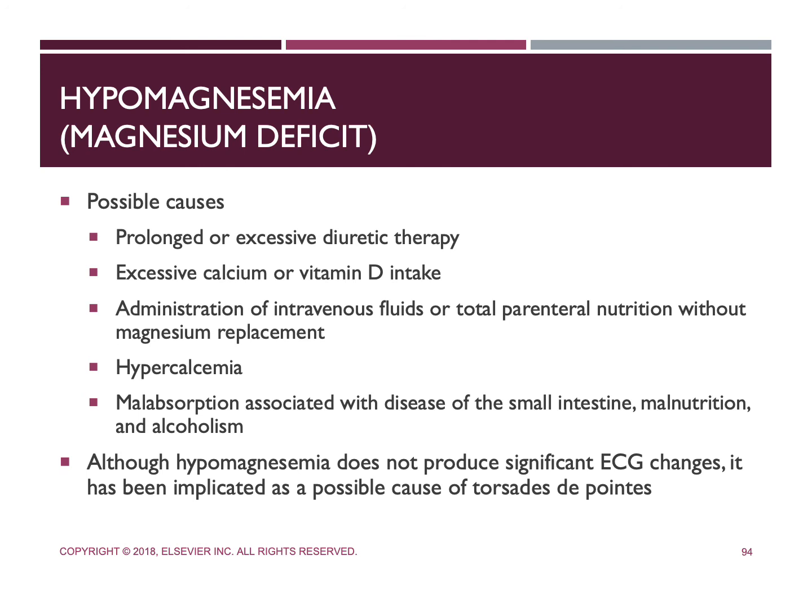We're typically not going to see any significant ECG changes with our hypomagnesemia, but it has been implicated as a possible cause of torsades de pointes. So that is something that, once again, it's implicated could be a cause of that.